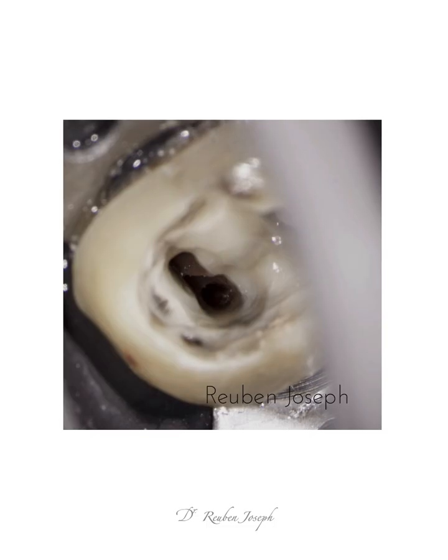What we are looking at here is a mandibular molar, the mesial root canal system with a mesiobuccal, mesiolingual and a middle mesial canal. But then this information is not clearly visible in this picture. There are three things you can do to improve this.